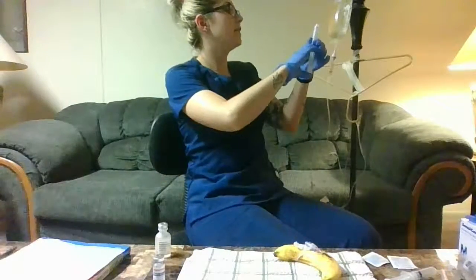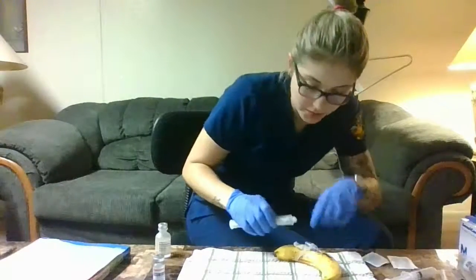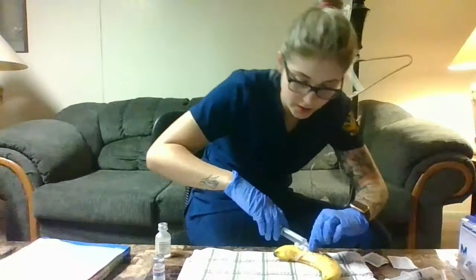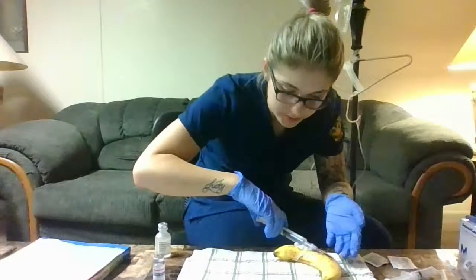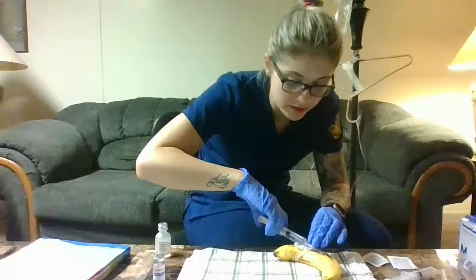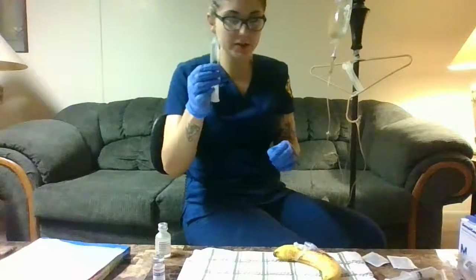Okay, make sure you have all the air out. And this was already cleaned. Put this in and do the 5 milliliters. And while you're doing that, make sure no pain, redness or swelling, no resistance while pushing this in. You will take it out after you put in the 5 milliliters.